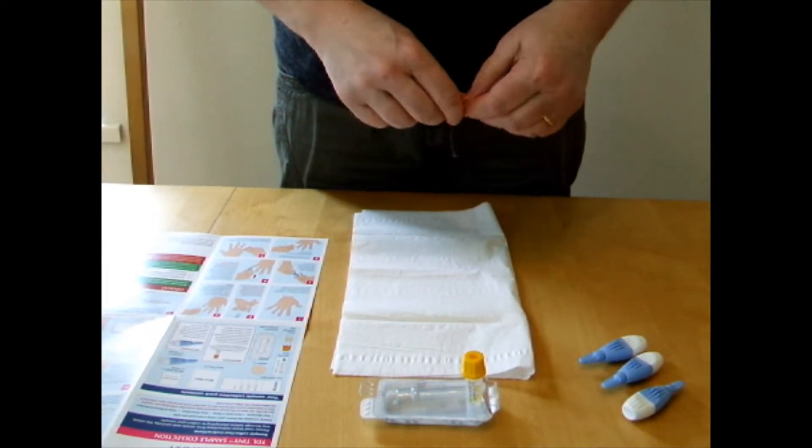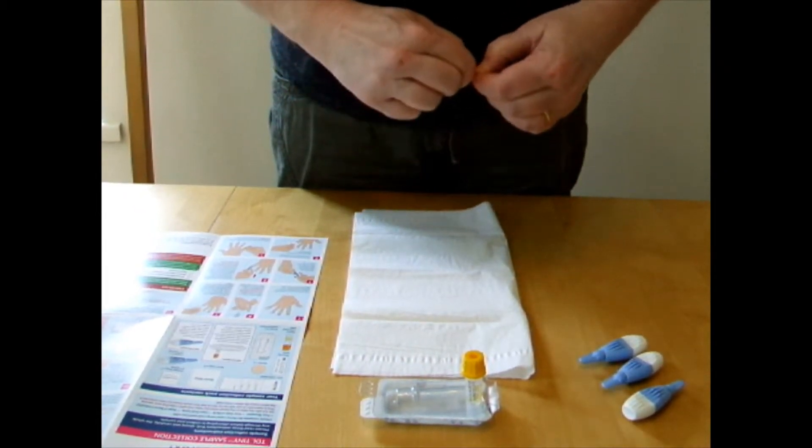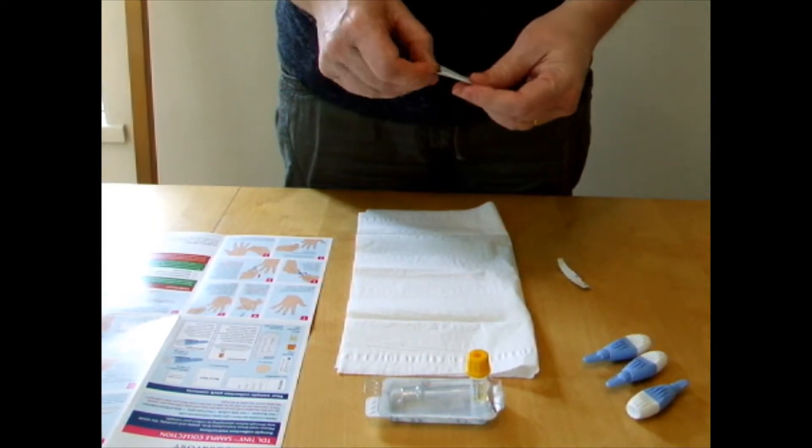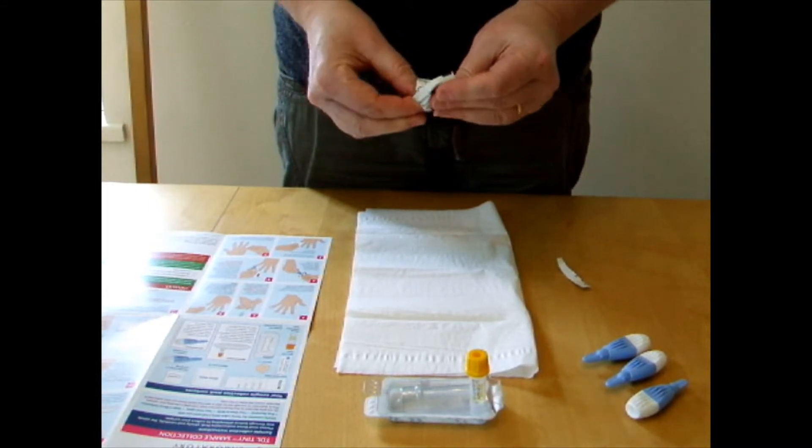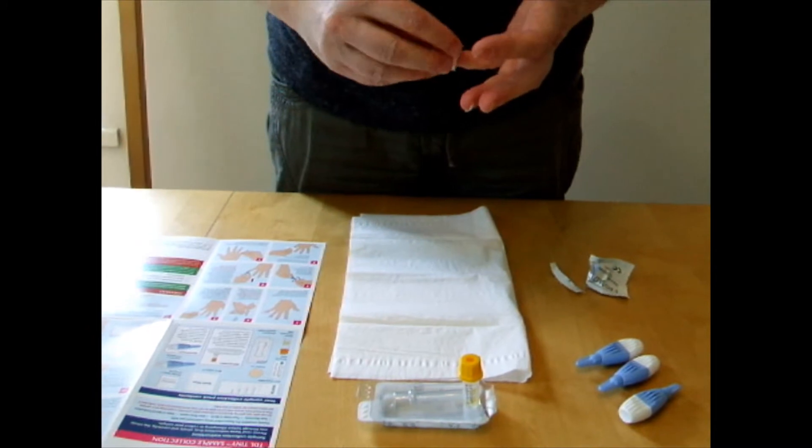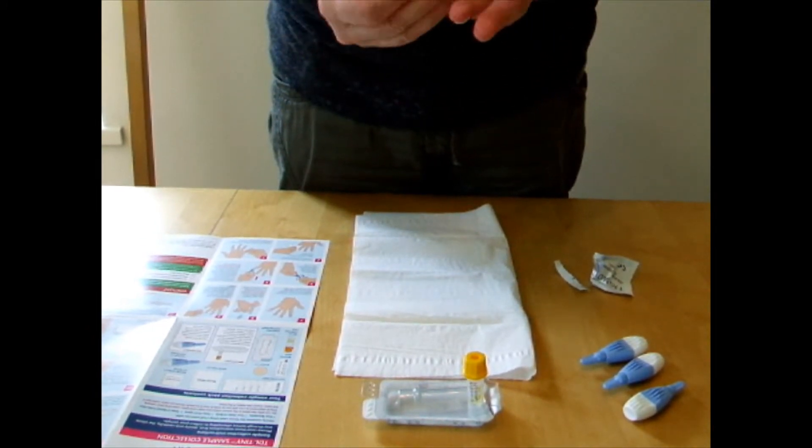You also have a wipe which has got alcohol in to make sure your fingers are clean. Wash your hands first, make sure your hands are warm because it will make it much easier to get the sample. If you stand up it's also easier to get a blood sample.